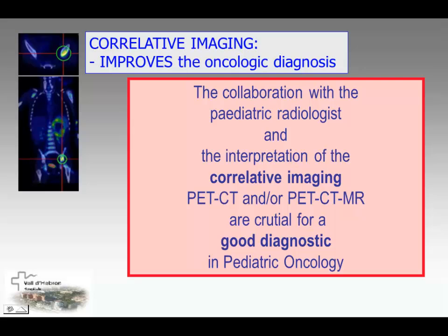Can NaF add anything? Can NaF PET add anything? Our rheumatologists are asking for more and more PETs of this, not very often of course, but sometimes yes, when they have discordances with the clinical symptoms. And we have detected areas of increased activity in more osteoarticular areas than they expected. It seems that the sensitivity can be quite good, but of course it's not a routine exploration in Still's disease. Thank you.